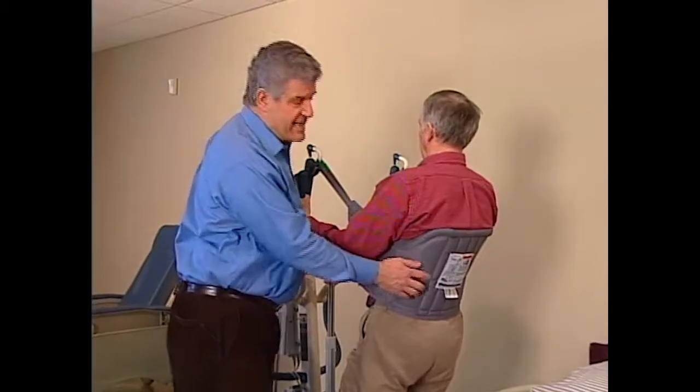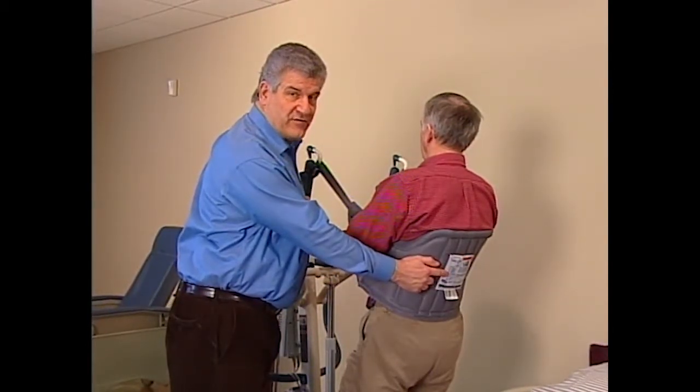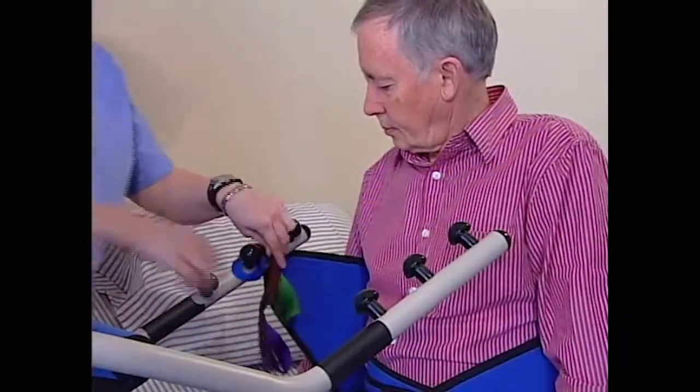Sling sizes are indicated on the labels. Refer to the sling chart in the owner's manual for dimensions. Although one lift will work for most residents, multiple hook-up points adjust to different body sizes.